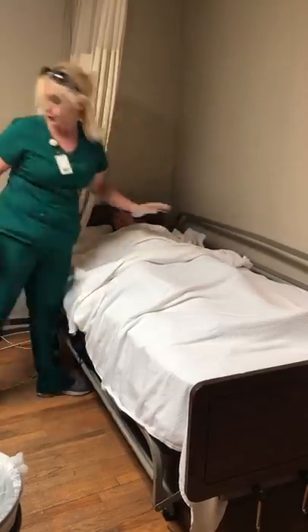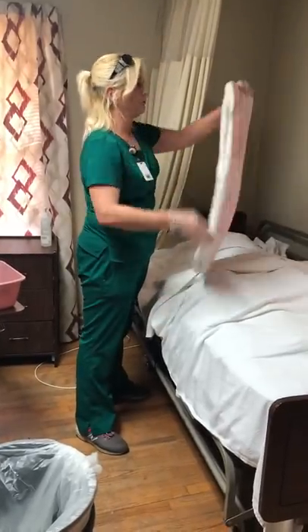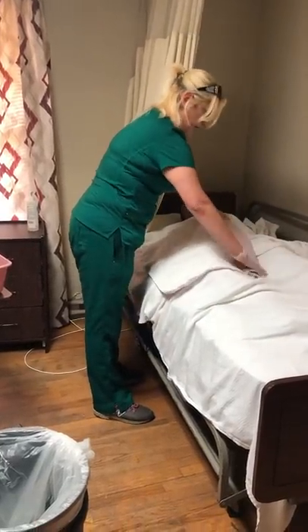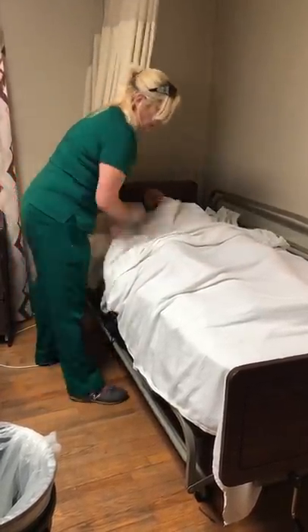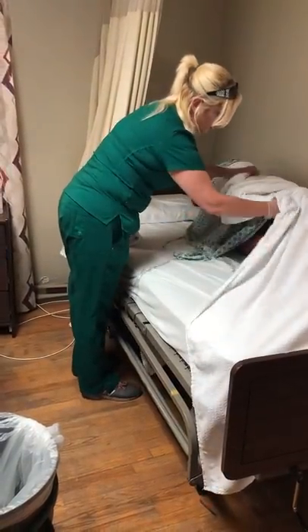Make sure they're covered. Now I'm going to put their waterproof pad on them. You'll have one side that's absorbent and one side that's waterproof — you want the absorbent side going towards your resident. I usually roll it about in half. Then we'll assist the resident to roll over, making sure we're doing our best to keep them covered.